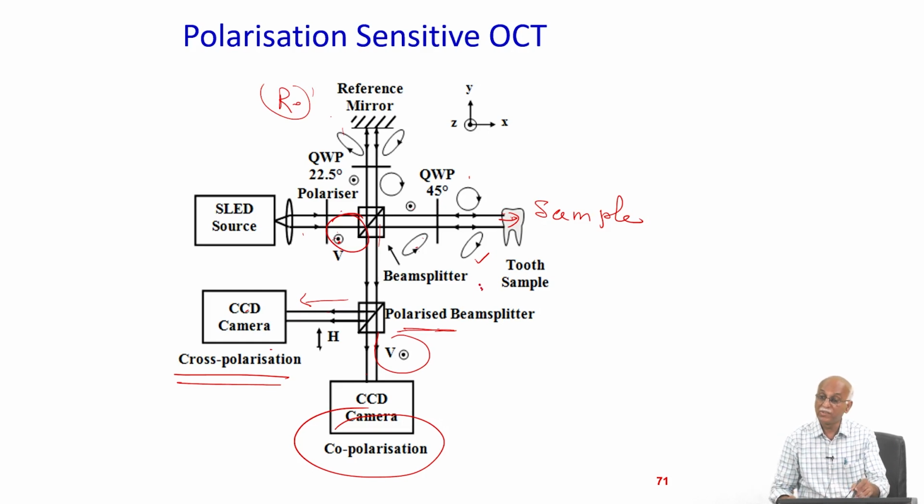So, those things are challenging over here, because polarization comes into the picture. When light propagates through the optical fiber, the polarization state may change. So, you need a special type of fiber to ensure that the polarization of the light which is reflected back does not change. So, there are lots of good ideas, and people are working on such device development and its usefulness.